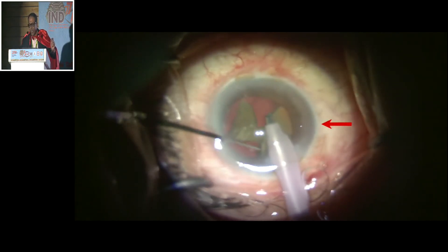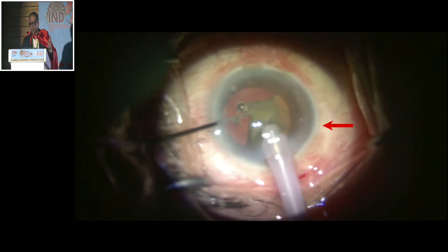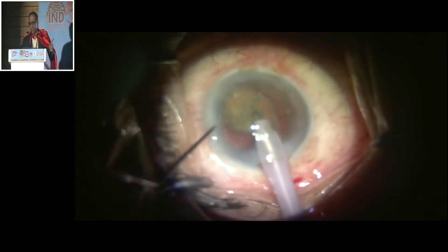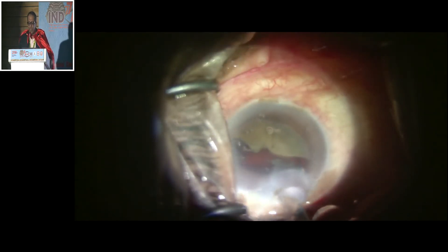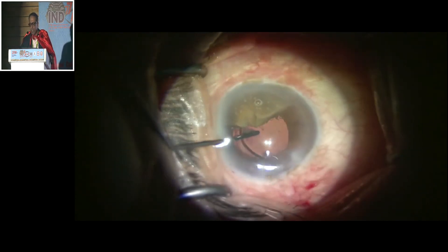This is continuing. Now it is not giving sufficient support, so I reposition and use a nuclear scaffold again to give the support. What next to do in this case? I decide to use a lens as a scaffold. After the nucleus scaffold, now it is the IOL scaffold.